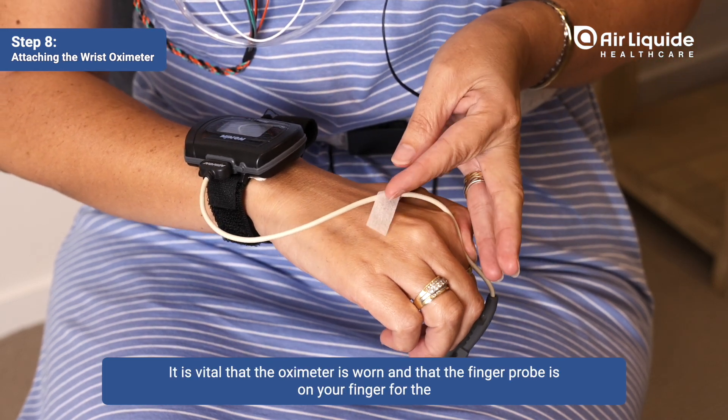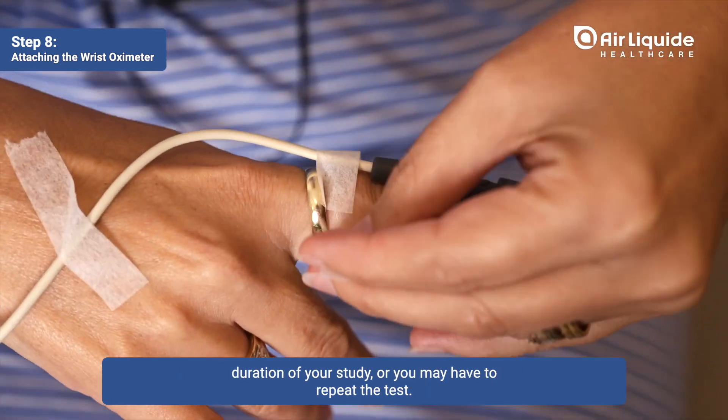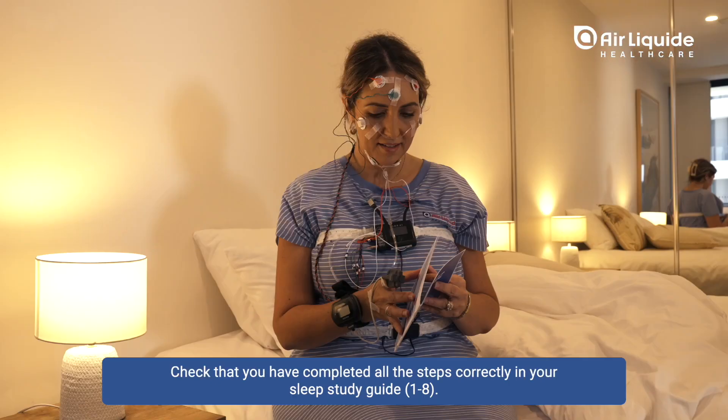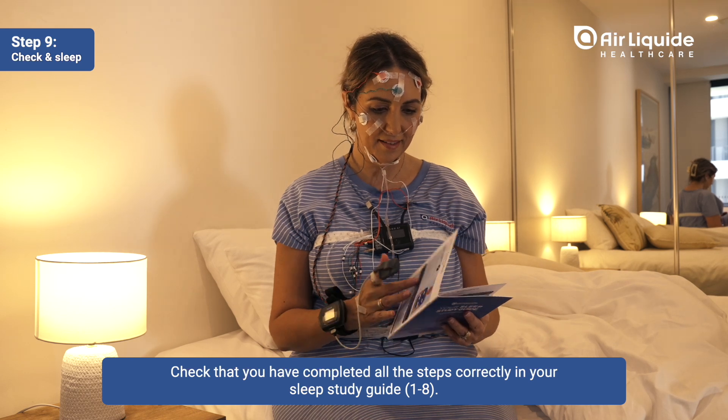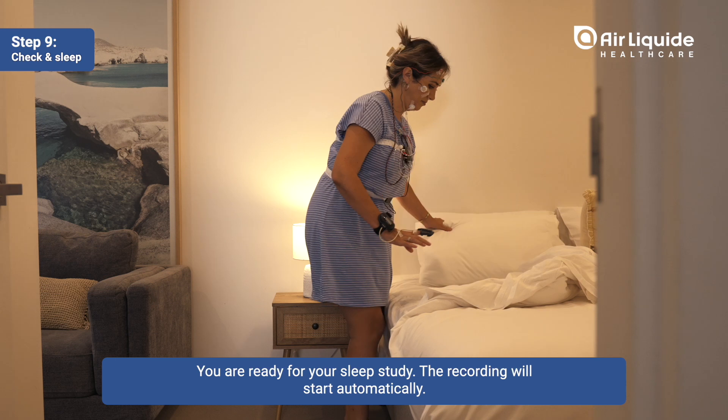It is vital that the oximeter is worn and that the finger probe is on your finger for the duration of your study, or you may have to repeat the test. Check that you have completed all the steps correctly in your sleep study guide. You are ready for your sleep study.